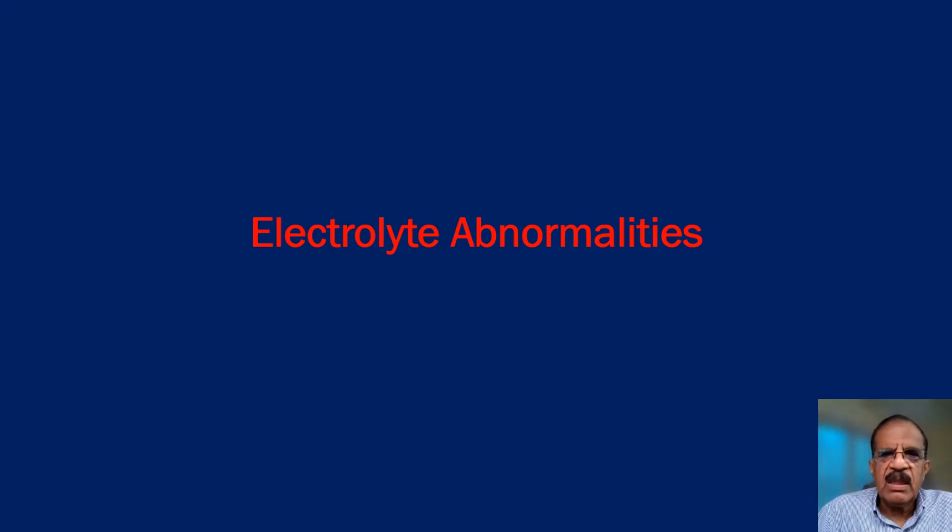Hyperkalemia, hypokalemia, hypercalcaemia, and hypocalcaemia. And they all have different case scenarios with different clinical settings. So for hyperkalemia, the commonest setting is renal failure, acute or chronic. Of course, there are many others. I will not go into the detail because our discussion is focused on ECG.